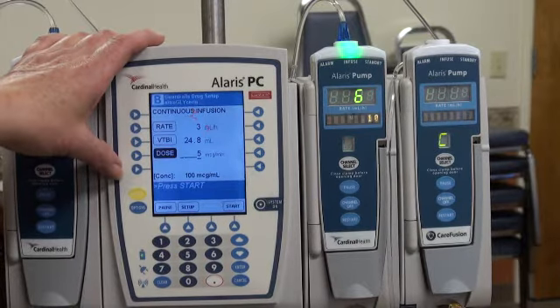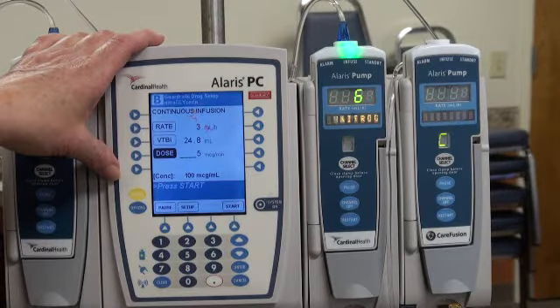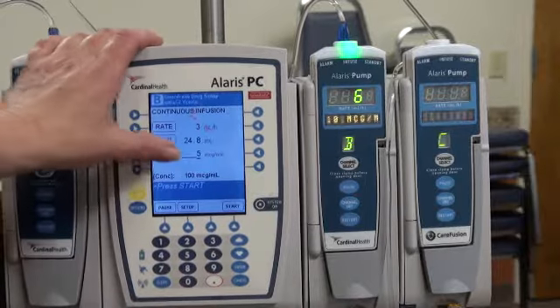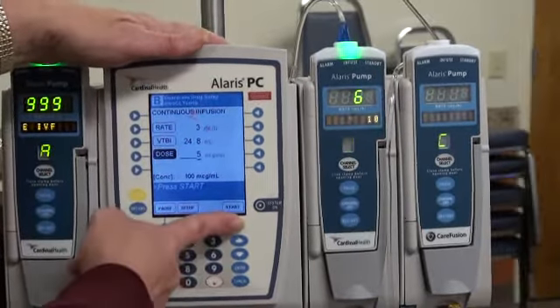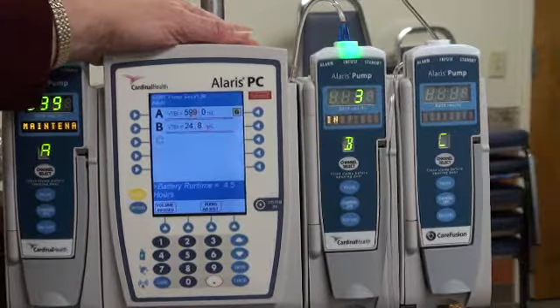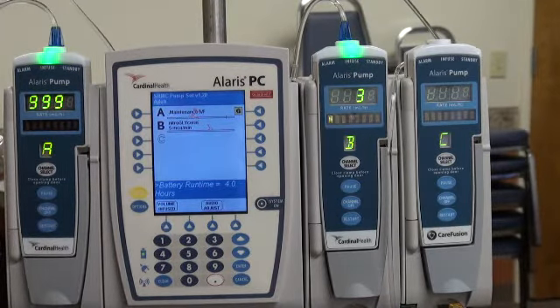You now have a pressure of 94/50. All right, they're getting too much nitro. You need to titrate down to 5 mics. You change it here, and it changes your setting on your rate automatically. You hit start. And you're titrated down to 5 mics a minute. And you'll leave it at that.